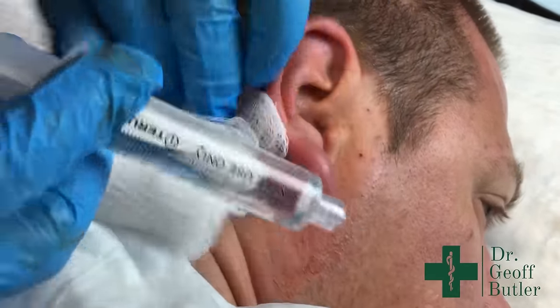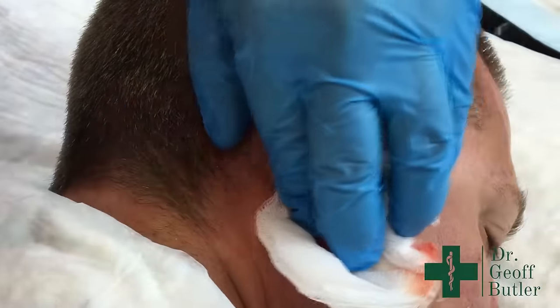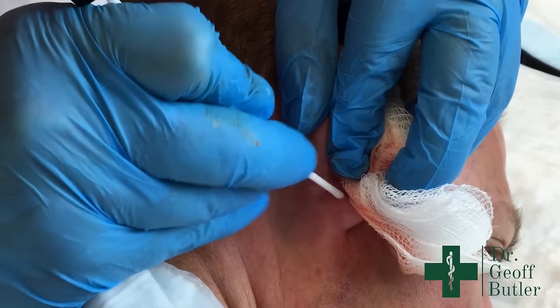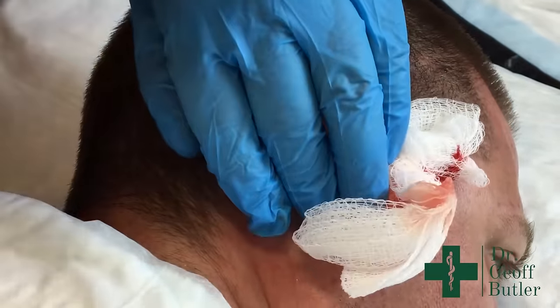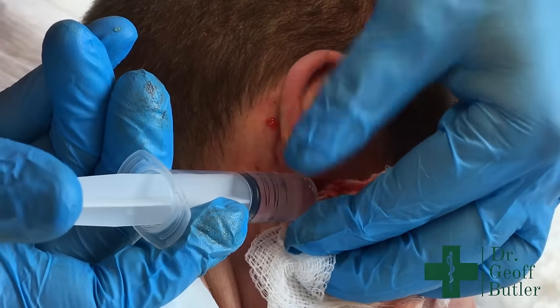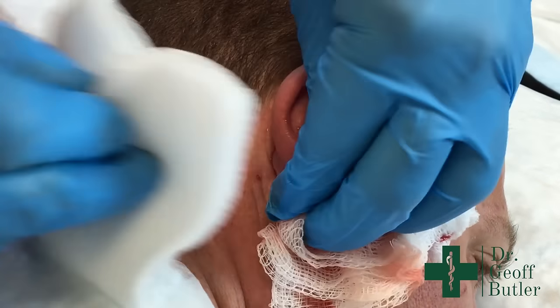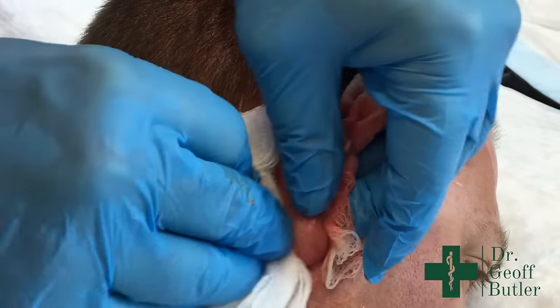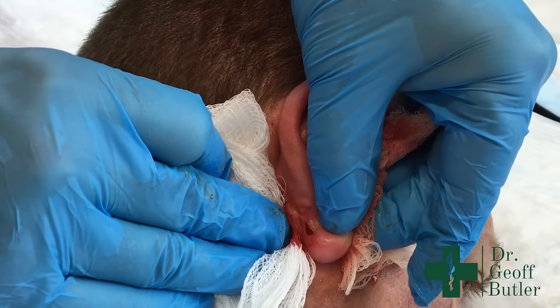I'm going to irrigate this before taking the swab. It doesn't matter if it's serous or serosanguinous — if we catch the bacteria, it'll grow. I'll send that off and irrigate one more time. The pressure from the front part is less swollen now. All we're going to do is put a pressure dressing on the ear — we're not going to seal it, that would be a mistake.